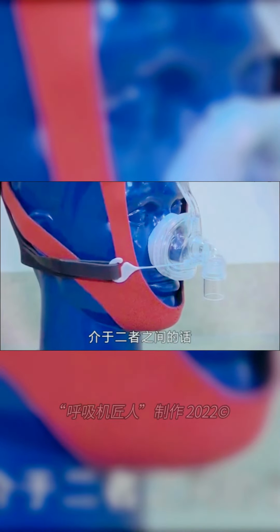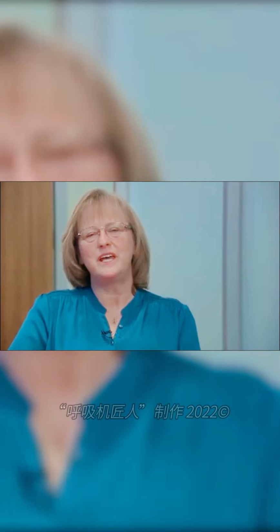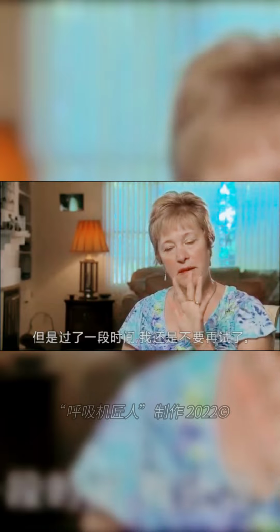If you're not sure if your mouth stays closed at night, but you can breathe comfortably through your nose, then the respiratory therapist can provide a chin strap that will prevent your mouth from opening. The second question to answer is, am I claustrophobic? The nasal masks are generally smaller and less cumbersome on your face than a full face mask. I definitely was not going to start out with one of these because I would feel like this was too much. But by the time I got to this, I could at least try it.